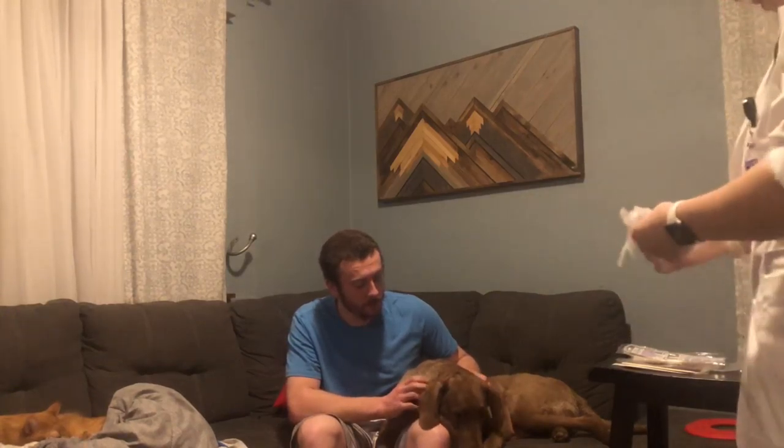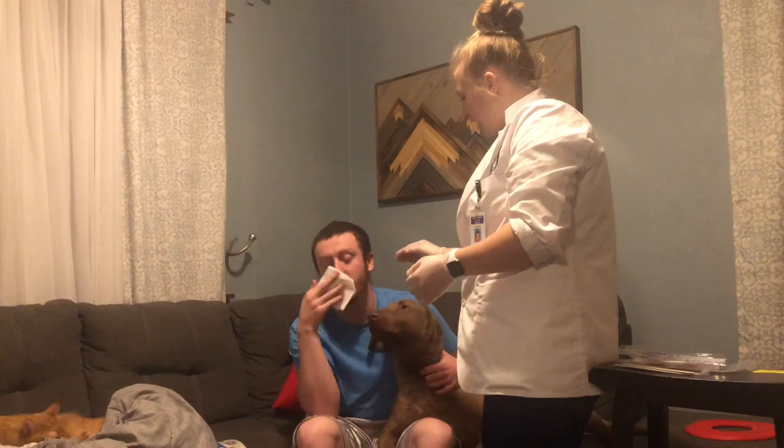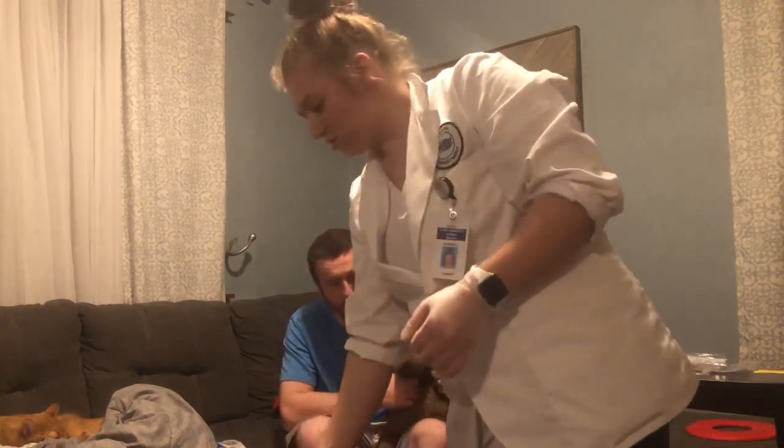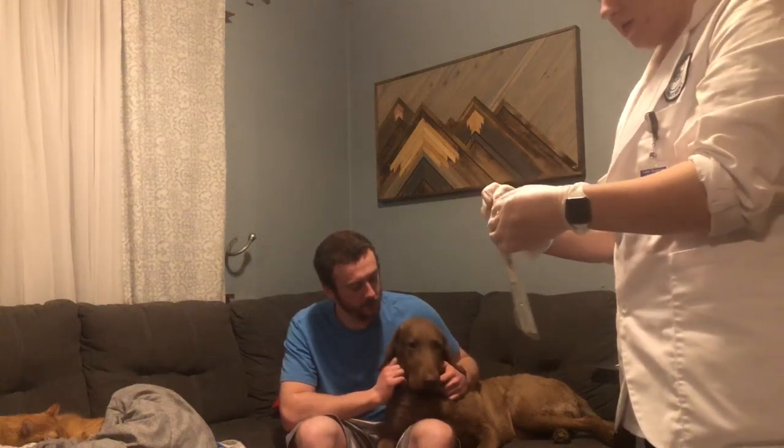I will be inserting a long q-tip-looking swab into the back of your throat. I will then wash my hands and put my gloves on. I'm going to have my patient blow their nose and cough into a tissue. I'm going to dispose of those properly. I will then open my swab for specimen collection without contaminating it, making sure not to touch the swab to anything besides my patient's throat.